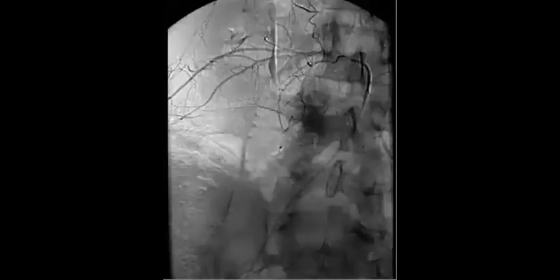And they say that maybe histological confirmation by CT guided biopsy, in the management, or surgical excision, or you can mention that it can also be treated by RF, radiofrequency ablation. In this case, they did something called preoperative embolization. You can see the catheter and they inject embolizing material.